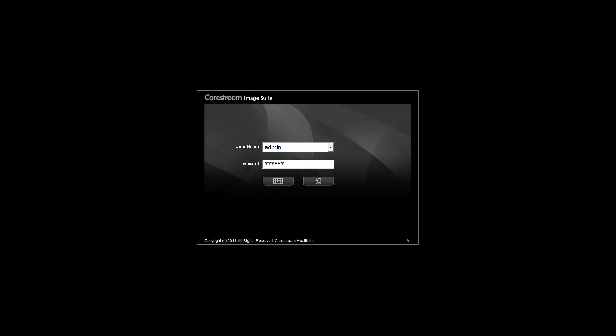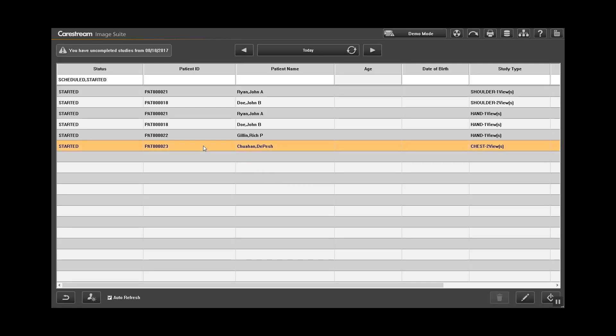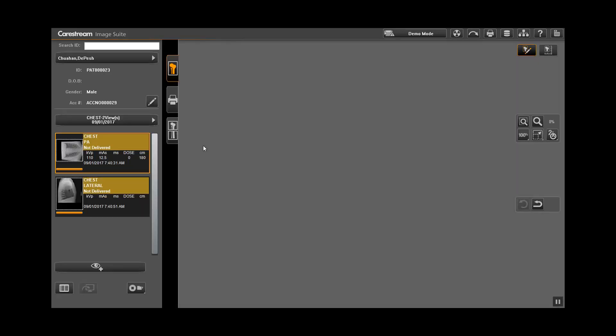Login to ImageSuite using your username and password. Either select the patient that is already completed or scan the patient. The study will be displayed. You are now ready to QC the image.